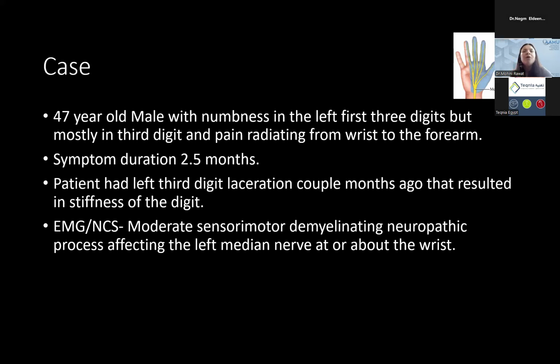Clinically they are showing median neuropathy, and electrophysiologically we did pick it up, so it looks like yes, we have answered our question. And here, this is what it is. It's a moderate carpal tunnel syndrome. The patient's clinical history presents with these symptoms which are consistent with that.